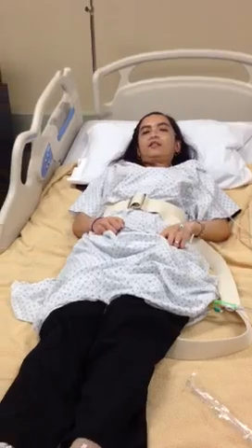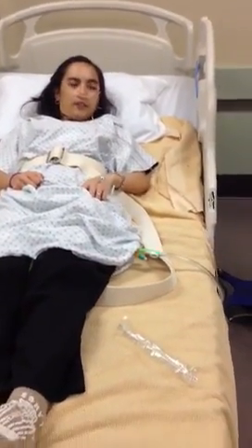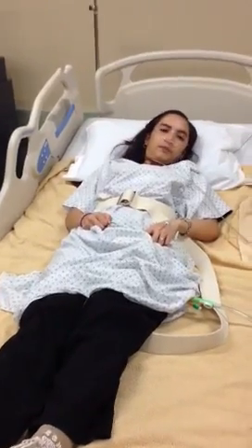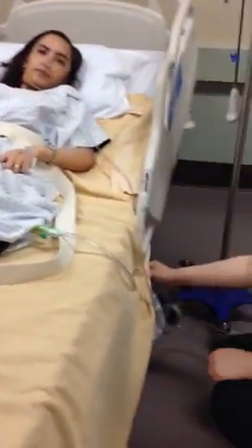When you are ambulating somebody that has a Foley catheter as one of their tethers, you need to make sure that the bag remains below the level of the bladder at all times.